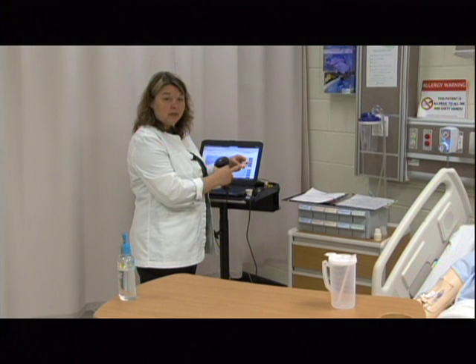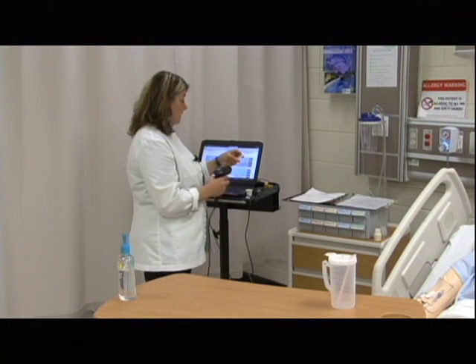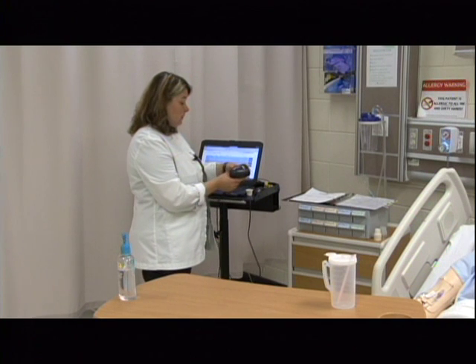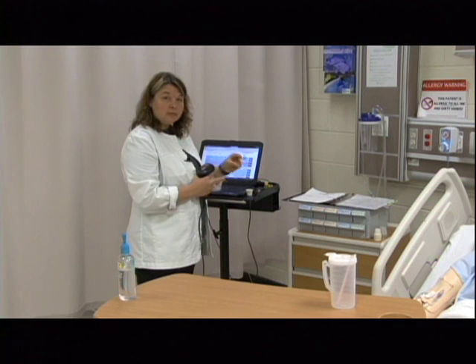I'm looking at the expiration date in here, and of course I'm going to verify Mr. Smith again here before I give the medications. I would then at this point scan the medication. Now with the Prinivil, I'm going to give a total of 40 milligrams of Prinivil. These are each 20 milligram tablets of Prinivil.